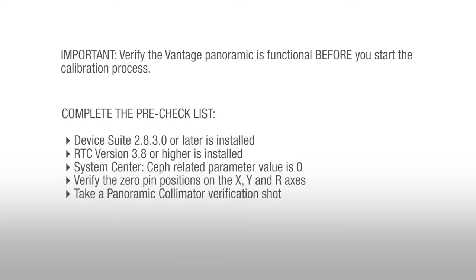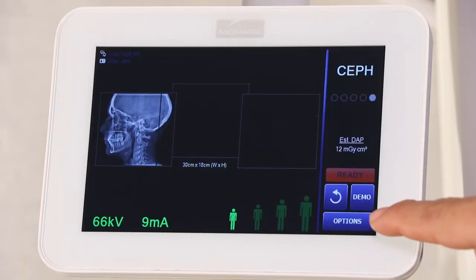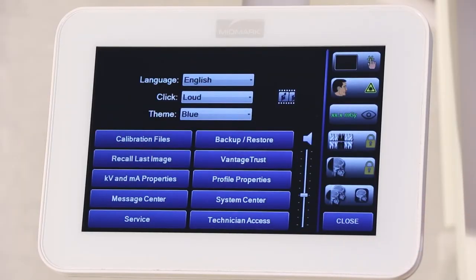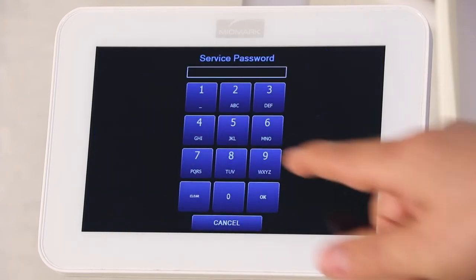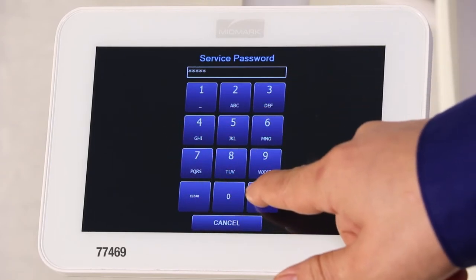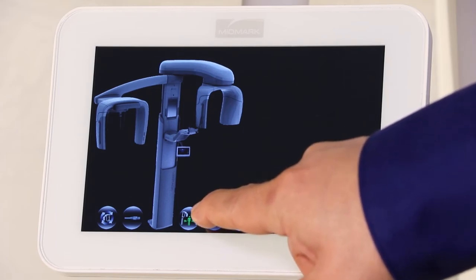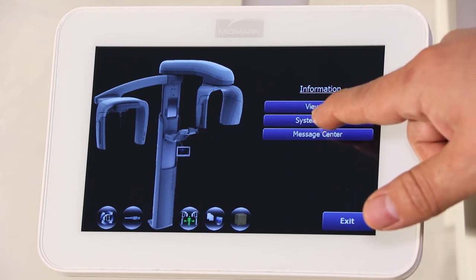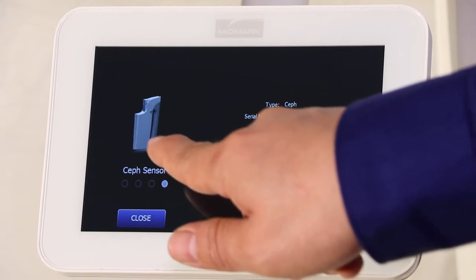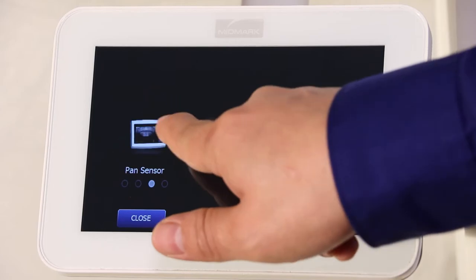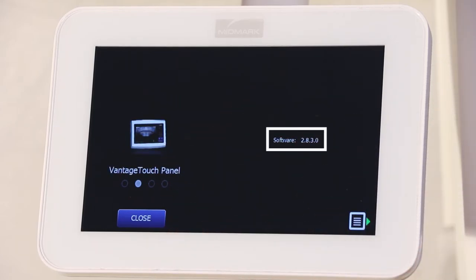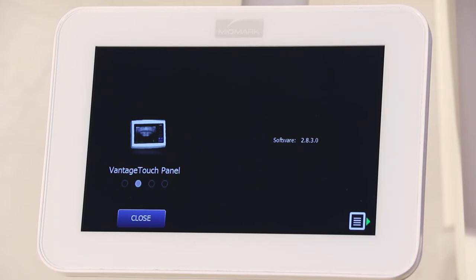We will now begin the pre-check process. First, verify Device Suite 2.8.3.0 or later is installed on the control panel of the Vantage unit. Start by selecting Options on the lower right of the Vantage touch display. Select Service on the lower left. Enter 77469 and select OK. Select the System Information symbol on the left or bottom as shown. Select System Center. If the Vantage touch panel is not displayed, place your finger on the image and slide it left or right until the Vantage touch panel is displayed. Verify that the Device Suite is version 2.8.3.0 or higher. If not updated, please contact Tech Support for further instructions. Otherwise, continue on to the pre-check for RTC version.